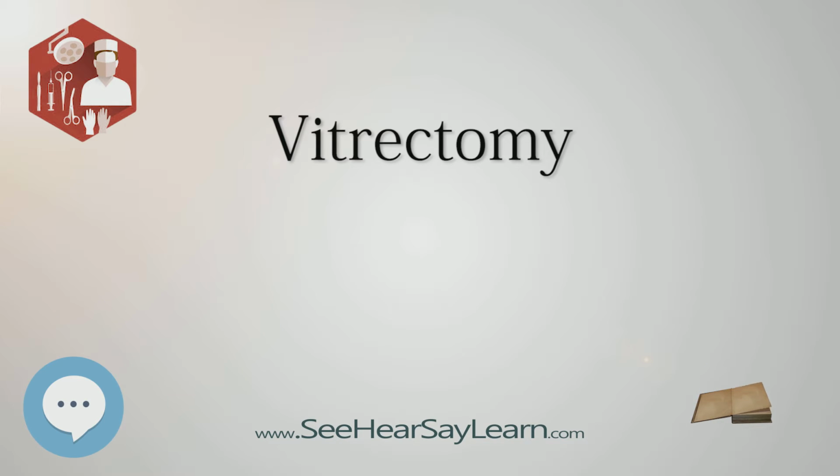Complications. Along with the usual complications of surgery, such as infections, vitrectomy can result in retinal detachment. A more common complication is high intraocular pressure, bleeding in the eye, and cataract, which is the most frequent complication of vitrectomy surgery. Many patients will develop a cataract within the first few years after surgery. Because there have been no published controlled trials evaluating the benefits and risks stemming from post-vitrectomy cataract surgery, ophthalmologists have no clear evidence to rely upon when counseling patients about cataract surgery.